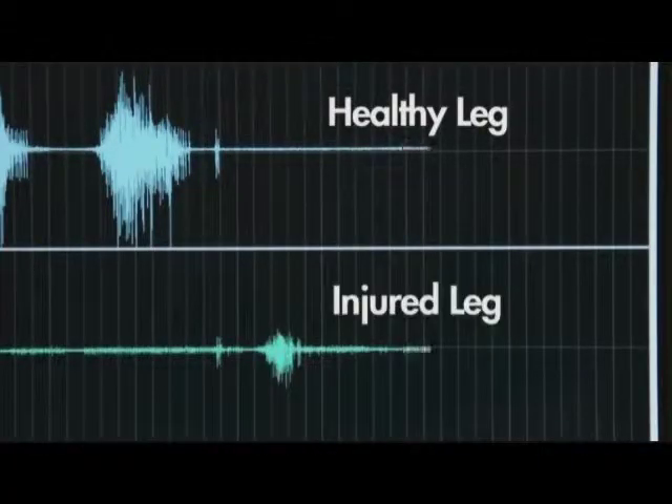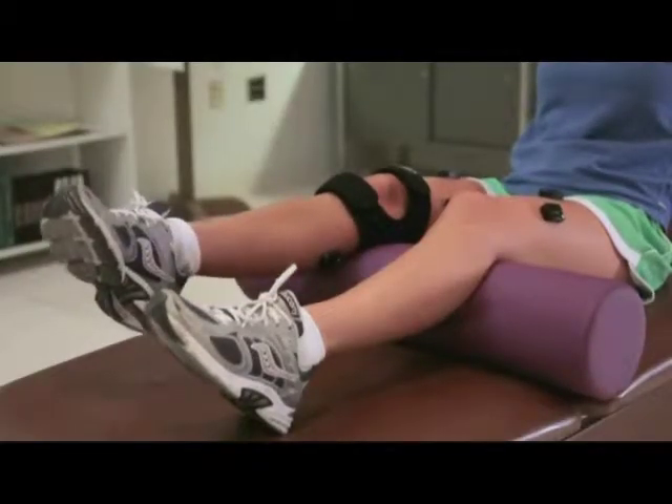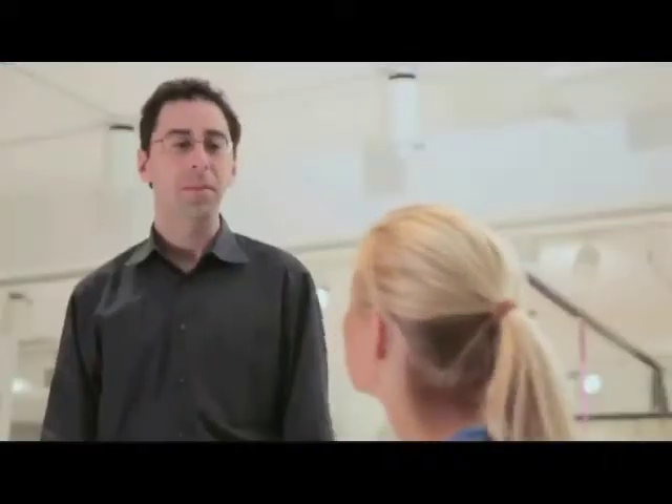It is likely Monica cannot fully activate her muscle as a result of the trauma. The accelerometers in the Trinio EMG system help measure inclination at the knee, and Monica's injured knee doesn't extend as much as her healthy one. Dr. Walker invites Monica to get more active and asks her to let them know if anything feels uncomfortable. They proceed to try wall slides.